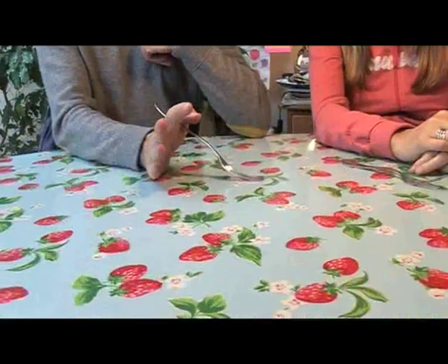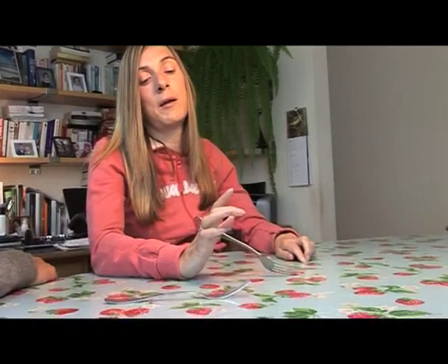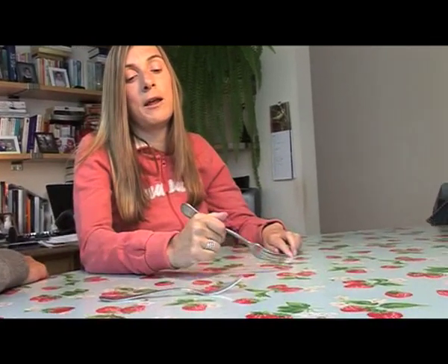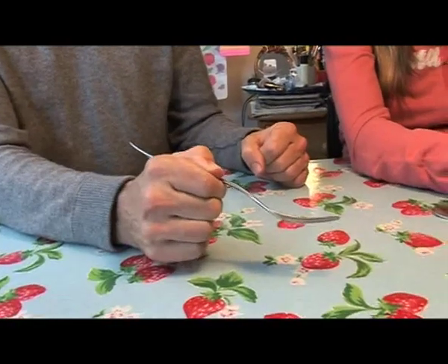Once you've got the correct dish position, you switch the free hand system on and your hand will open. When I open my hand, I move my shoulder back and then forward a tiny bit to get the right grip. Once I've got the right grip, I lock it like that — and then that's it, we have it.